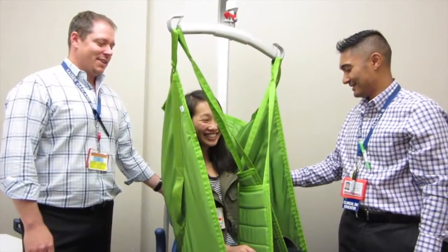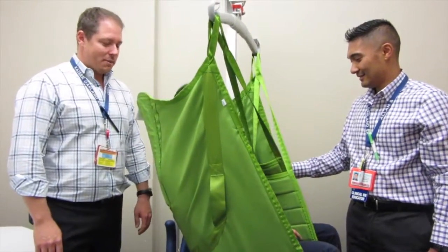Go to the light, Christine. All right, that's as high as Christine's going to go in a medium sling.